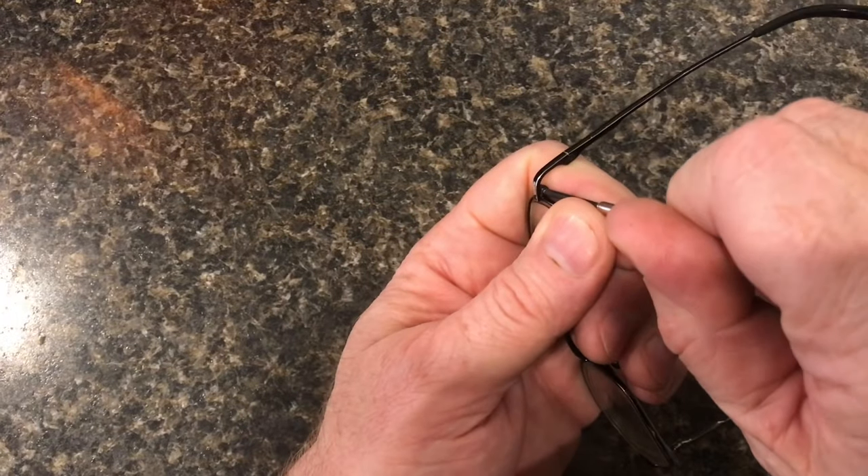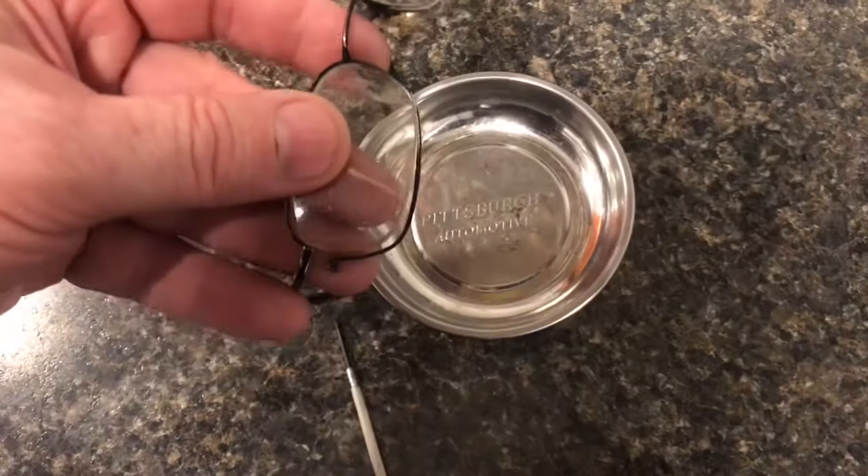With a small Phillips screwdriver, I'll loosen up the screw. We can pull the lenses out now.